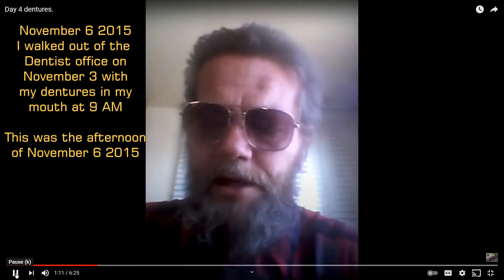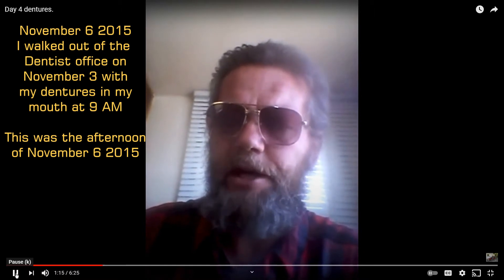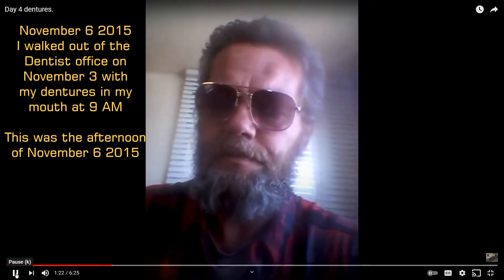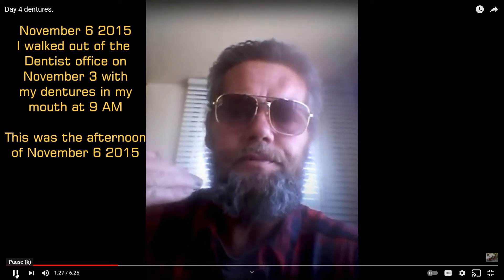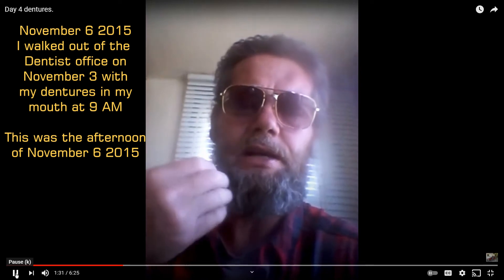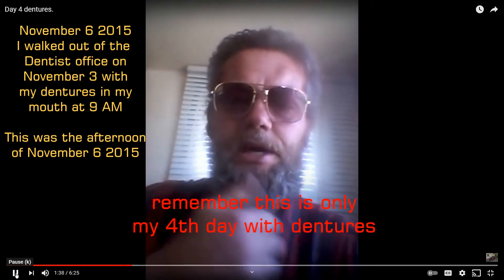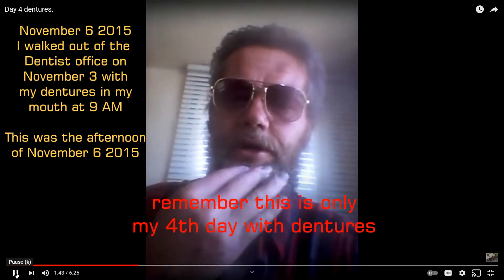Other than that, that was just a piece of chicken from the chicken and pasta alfredo. There you go, see? Just a piece of cooked chicken. It's a little difficult to chew because you can't feel the food. So you have to use your cheek and your tongue as a guide to keep it between the molars. And if your bottom plate is loose at all, it'll want to tip up on this side if you're chewing on this side, and vice versa.